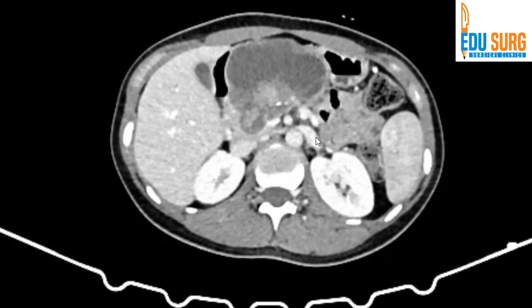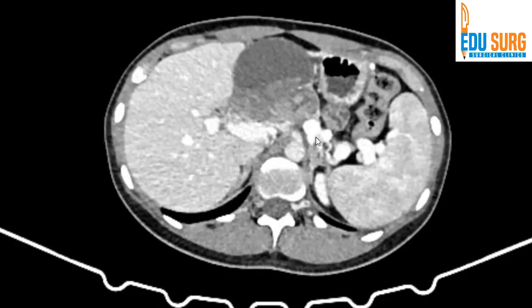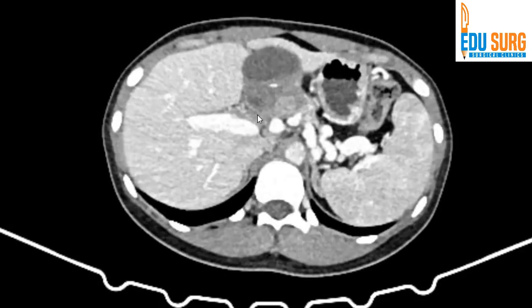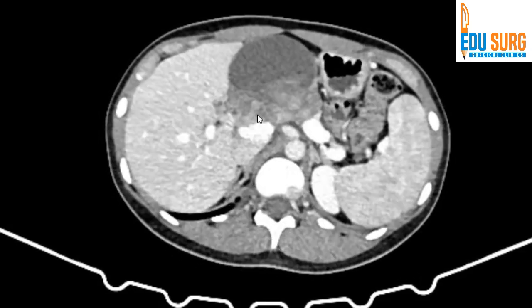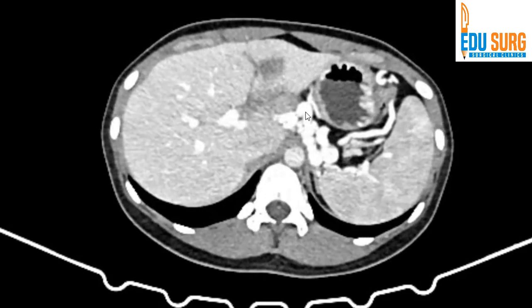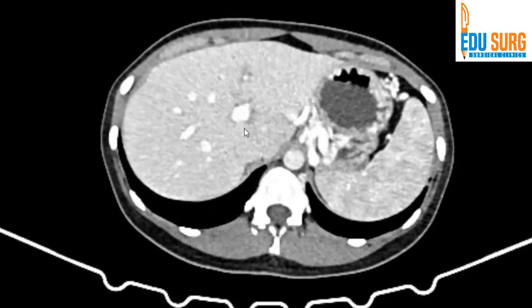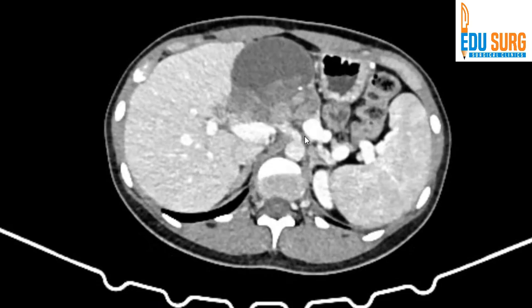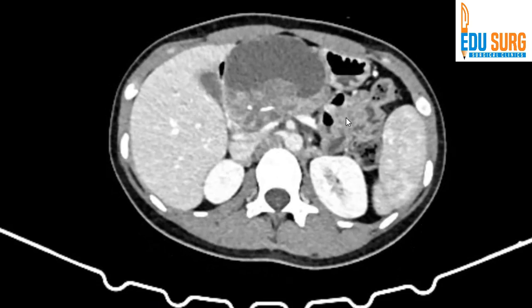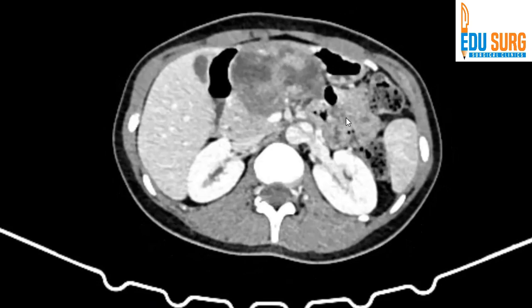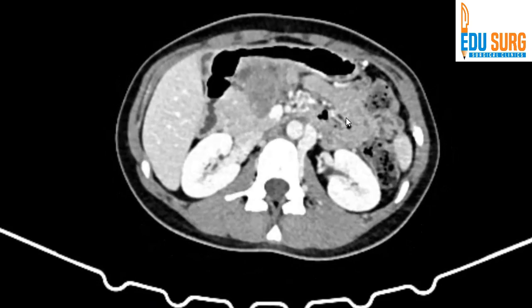This is the renal vein. You can see a lot of collaterals in the area. The left gastric vein is seen very nicely here, and it will be important to preserve the left gastric vein if possible, while ligating all the collaterals, because there will be some area of drainage of the stomach that will go through the left gastric vein.